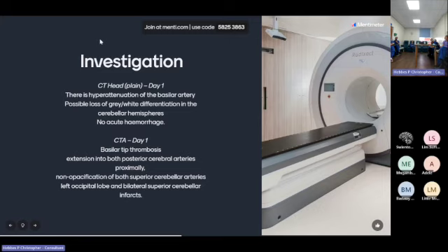But I'll be really honest, I'm not a radiologist, and I'm not used to looking at scans of people that are young and otherwise fit and well. In older people where there's cerebral atrophy, it's really obvious where you've got the gyri and sulci. In somebody that's young, I sometimes look at the scans and think that head looks a bit tight, and it's not, which is one of the reasons we have radiology specialists to look at the scans for us. I'm just not used to looking at scans of young people.